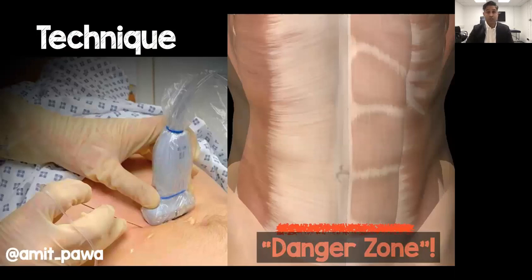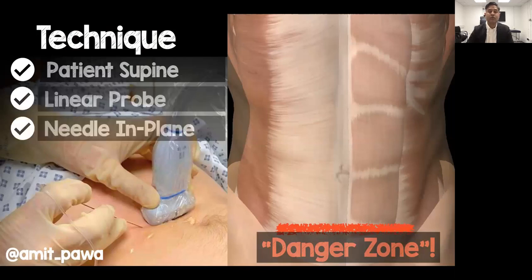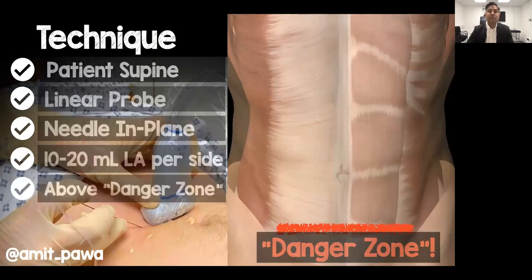For technique, we tend to have patients supine. We use a linear probe and inject in-plane from lateral to medial. We tend to inject somewhere between 10 to 20 millilitres of local anaesthetic per side, and we aim to stay above the arcuate line — what I call the danger zone — that red line below which we don't want to inject.